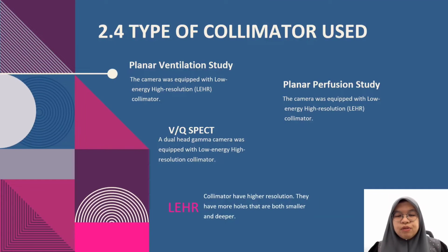These three procedures use the same collimator, which is LEHR. LEHR is a low energy high resolution collimator.